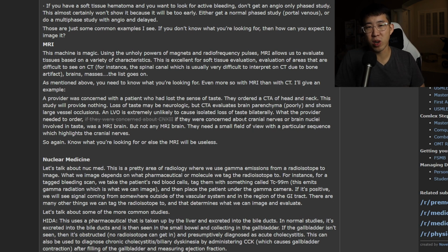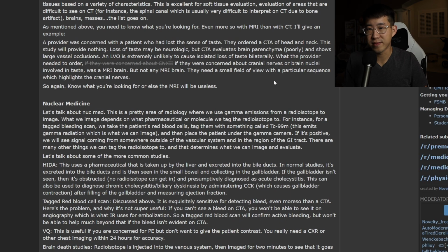Usually there's a big questionnaire of any metal pieces or fragments that are in the patient that you also need to fill out to make sure that they don't have anything else that could get disrupted by all the magnetic fields in the MRI.